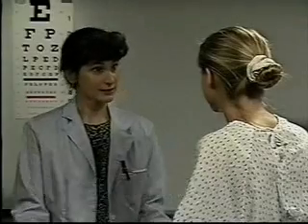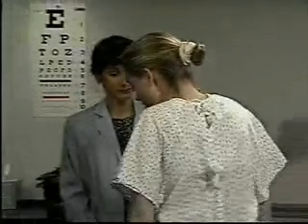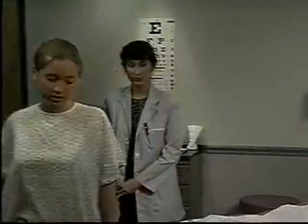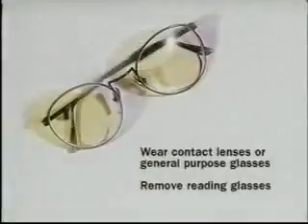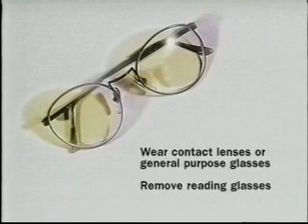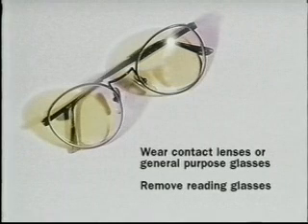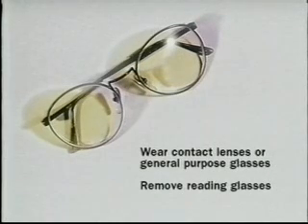Begin the eye examination by assessing the patient's visual acuity. To do this, have the patient stand 20 feet from a Snellen eye chart. If the patient wears contact lenses or general purpose glasses, tell her to wear them. But ask the patient to remove reading glasses, because they blur distance vision.